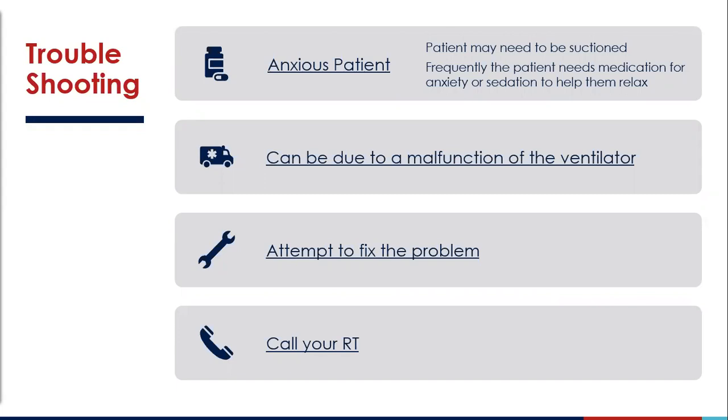Troubleshooting. For an anxious patient, the patient may need to be suctioned. Frequently, the patient needs medication for anxiety, pain, or sedation to help them relax. Pain is a huge factor in these patients, and all guidelines recommend treating the pain first.